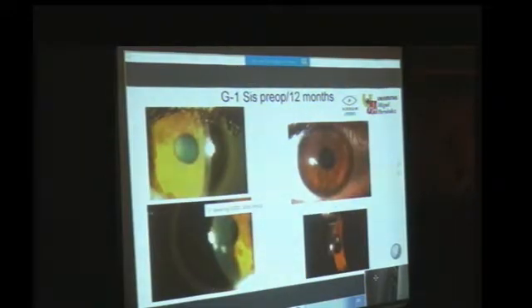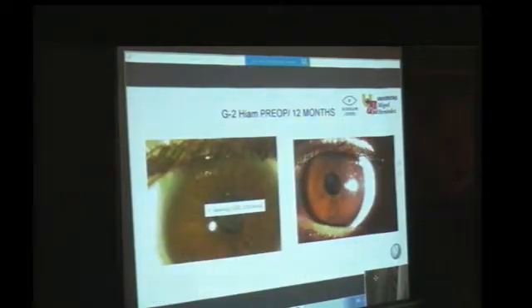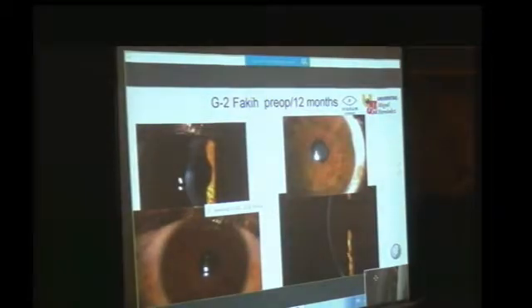This is from pre-op to 12 months, in which you can see that opacities that were present in the left slides in the parapupillar area are much less evident after 12 months. So these scars are undergoing a remodeling, an improvement, and corneal transparency is partially recovered, which is remarkable. This is one case pre-op and at 1 year as well. This is another case in which we had an opacity in the paraxial area. Look here that this does not exist at all after 12 months, and the presence of the lamina, which is transparent, is clearly visible over there.